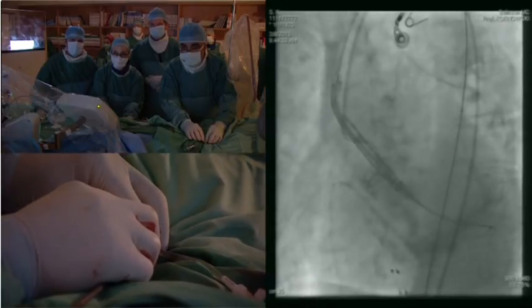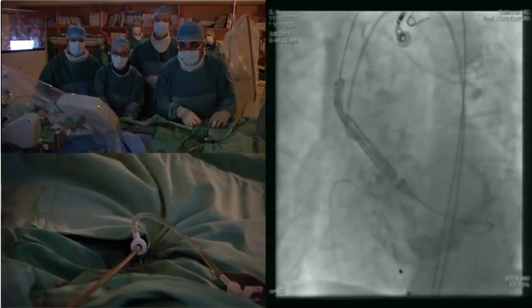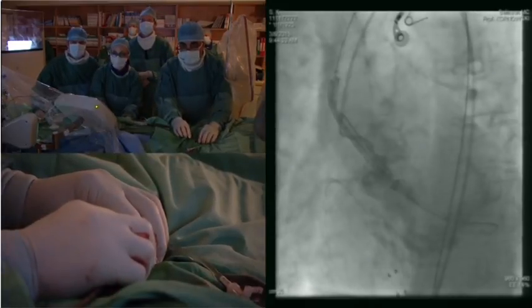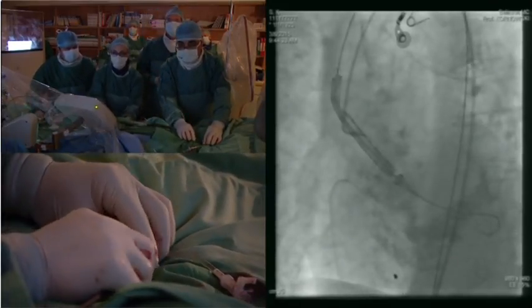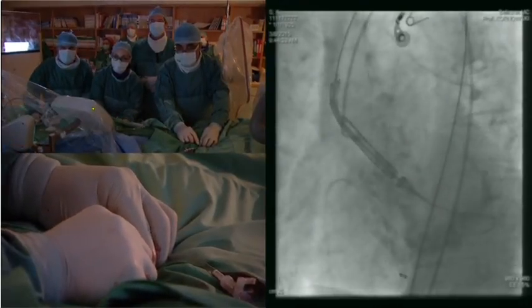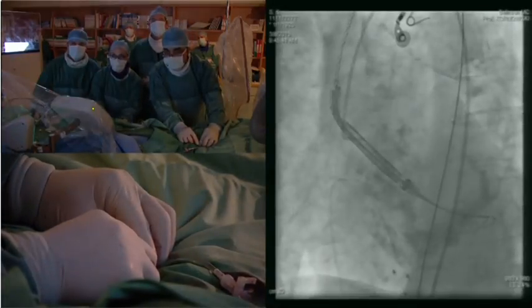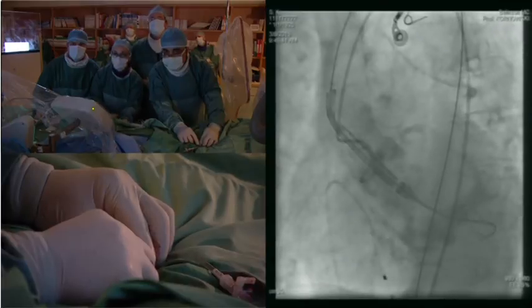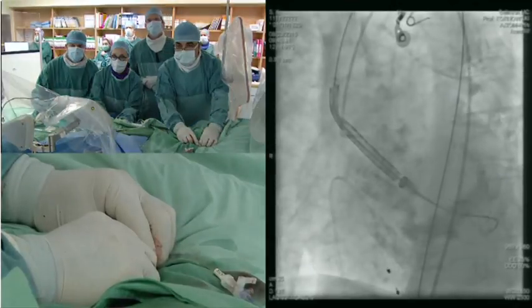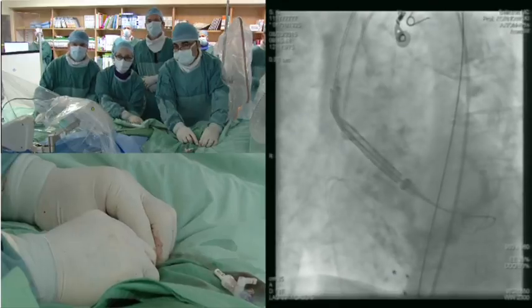Ran, when there is extensive calcification, people recommend balloon dilatation before inserting the valve, is it so? We are not too afraid of the calcification, and I don't think the pre-dilatation, which is usually a gentle pre-dilatation, makes much of a difference. And if needed, we'll be able to do post-dilatation afterwards. I think this is a good place to start.